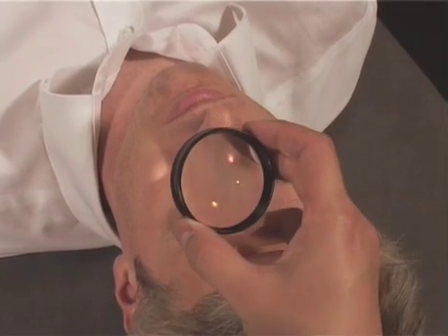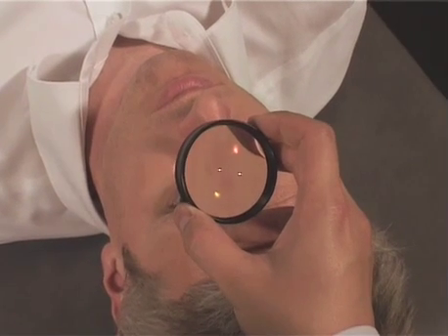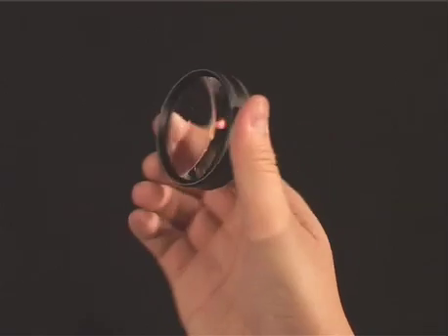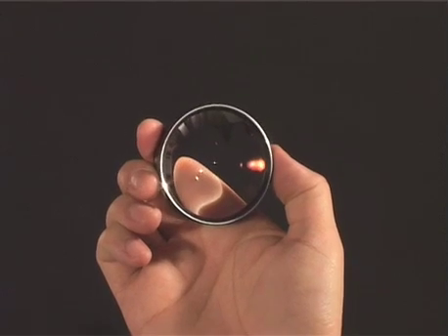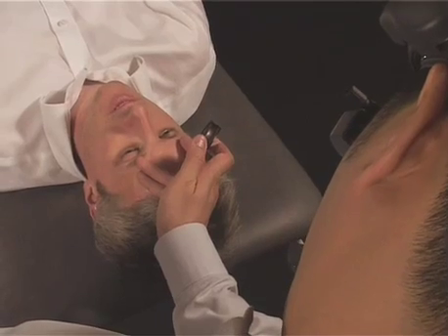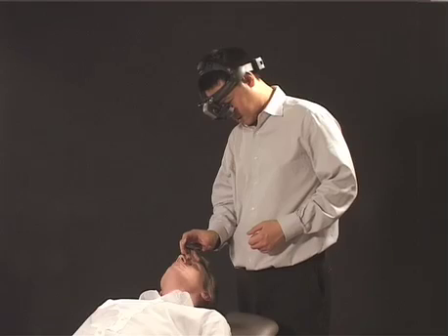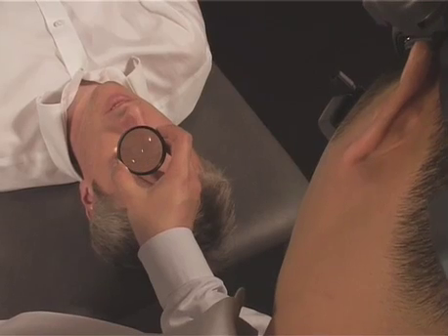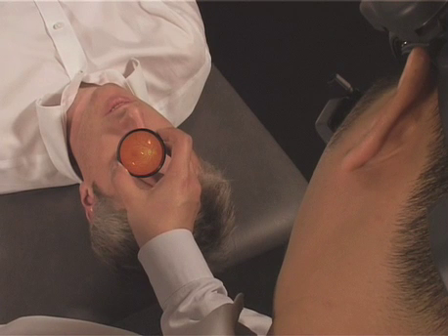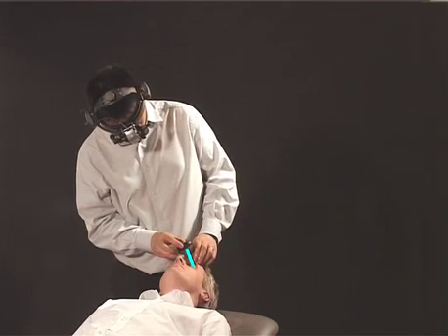Then position the condensing lens starting close up to the patient's eye. Condensing lenses are generally optically asymmetric and they are intended to be used with the white rim that's on one side of the casing facing towards the patient. You need to keep the patient's pupil, the condensing lens and your illumination beam anchored together along an imaginary straight line. Slowly pull the lens towards you until you begin to get a view of the fundus.